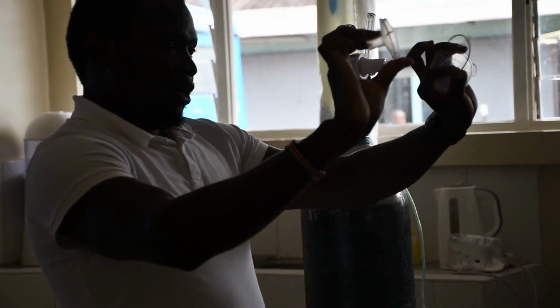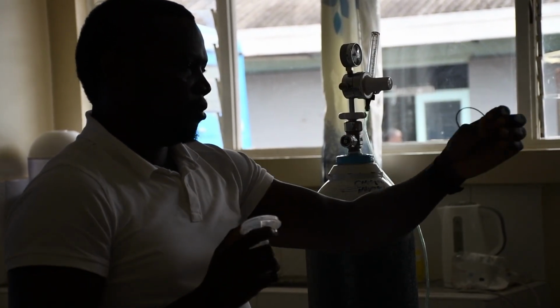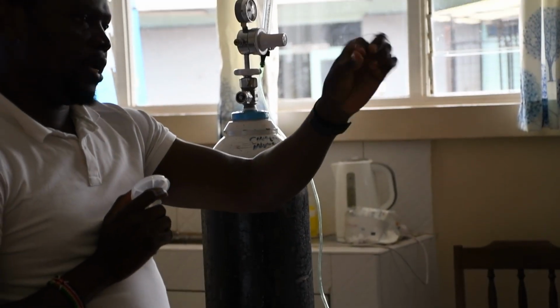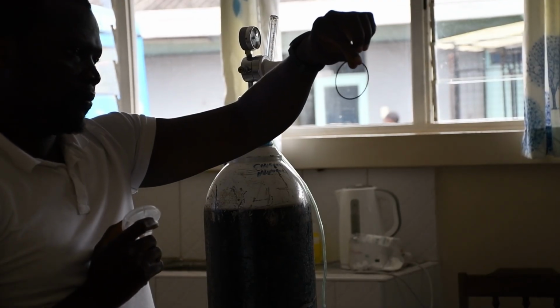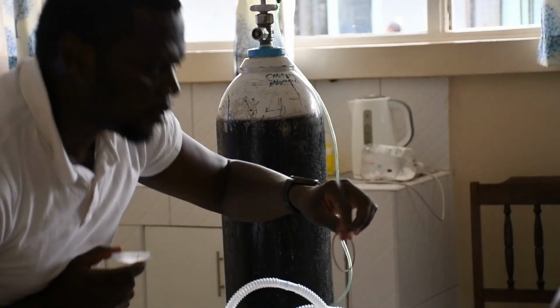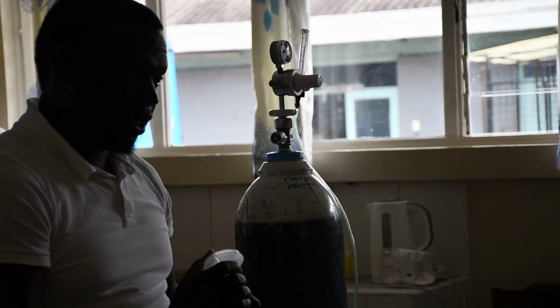So the other parts are three parts. You have two of the plastic housings, and then you have the ring. Rings are some of the devices that we have. Why do you use these rings? Yeah, to prevent leakage and provide a tight seal, okay?